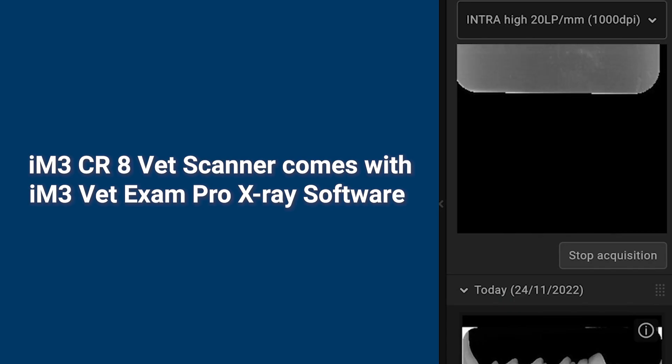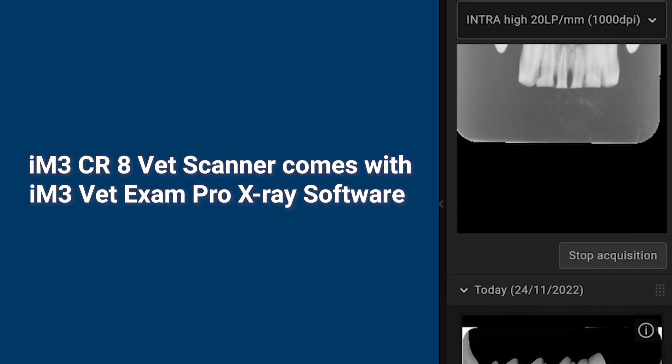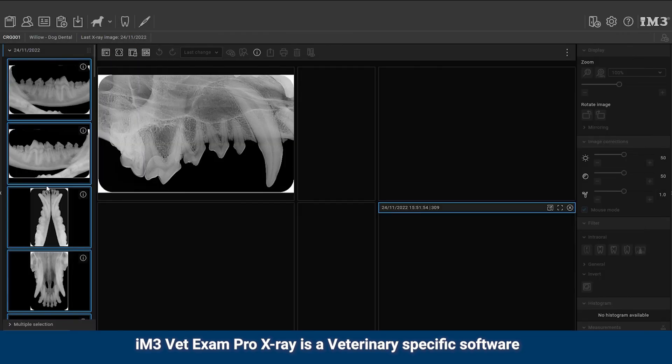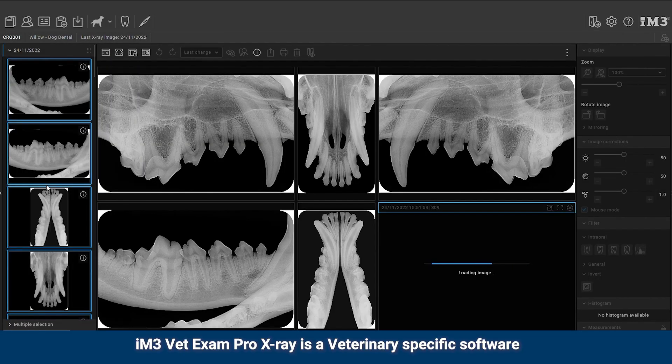The IM3 CR8 vet scanner comes with IM3 Vet Exam Pro X-ray software. IM3 Vet Exam Pro X-ray is a veterinary-specific software.